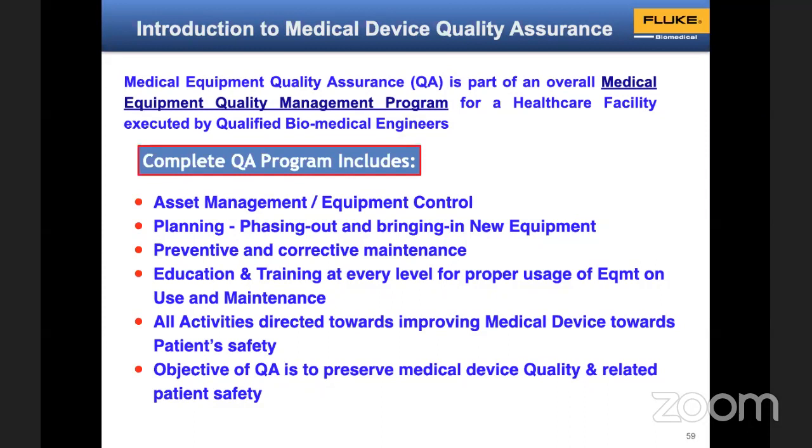Equipment is used across departments. A medical ICU may take 4 ventilators from surgical ICU, and surgical ICU may take 10 infusion pumps from the emergency department. So they have to know which machine is moving where and the location of these machines. And these machines have to be tested and calibrated regularly according to their importance.